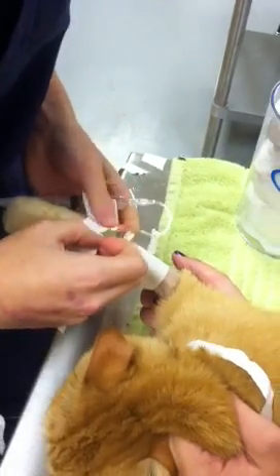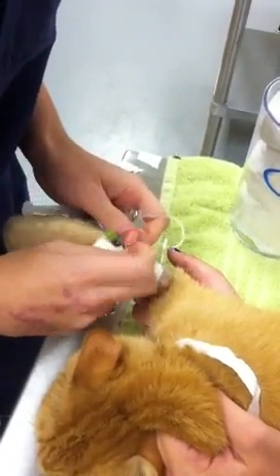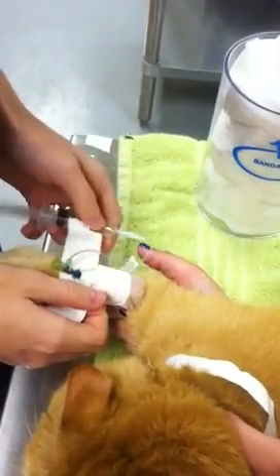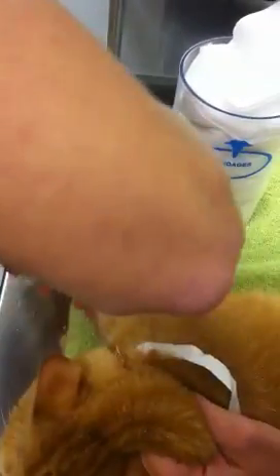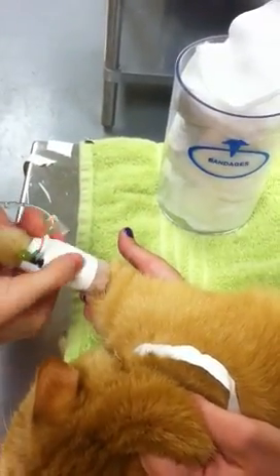I'm going to slip this under — I've already pre-cut a slit into this to make for easier anchoring. Some people don't always put that slit in there but it can help. I'm going to bring that around ensuring that I am able to change that T-port if necessary.